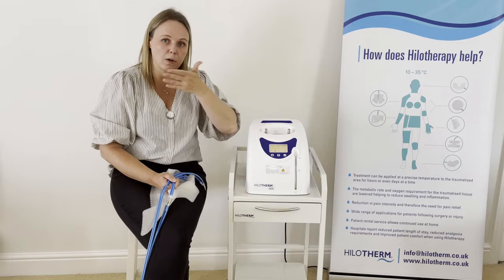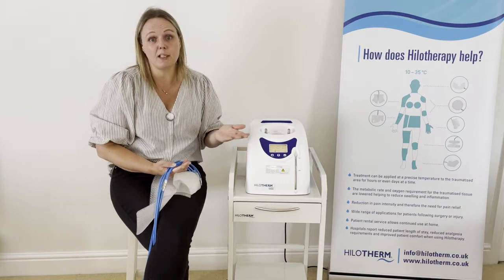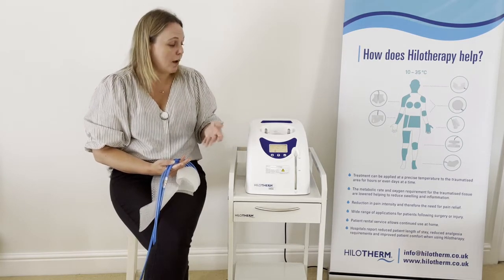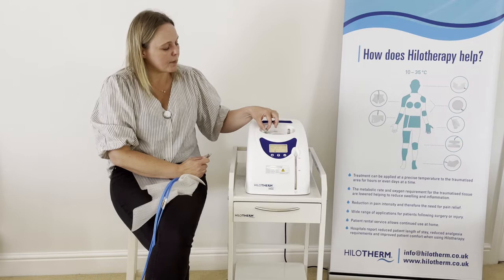It is also possible to connect two cuffs — for example, if somebody has a mandible fracture and a zygomatic fracture, you could have one cuff on the jaw and one on the eye area. Or if somebody has had a bilateral knee replacement, you can treat both knees at the same time. It can also be very useful for breast surgery patients.